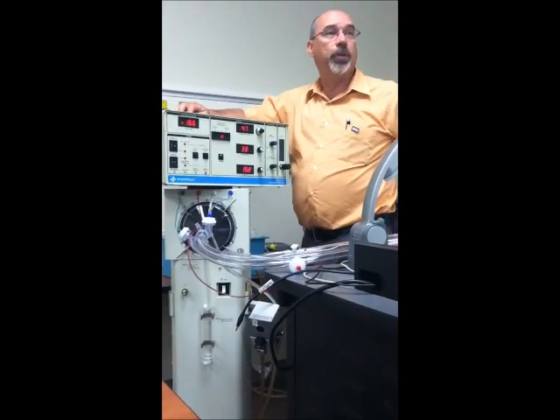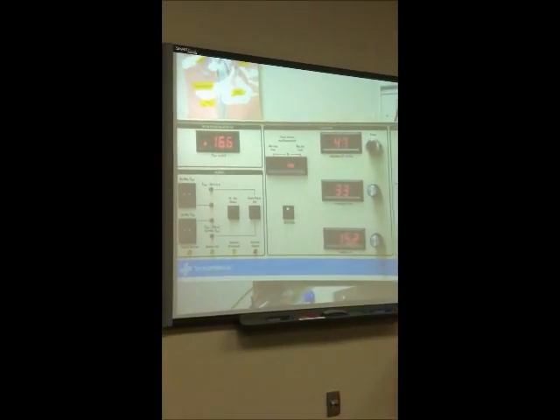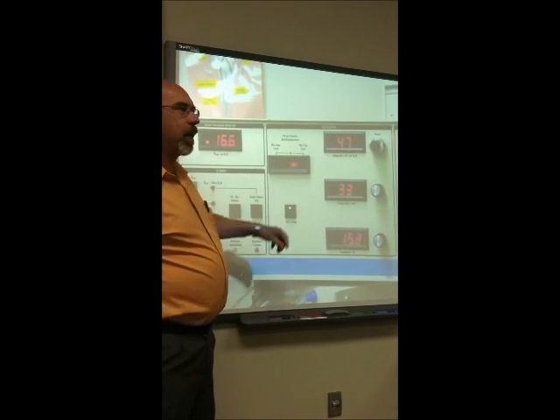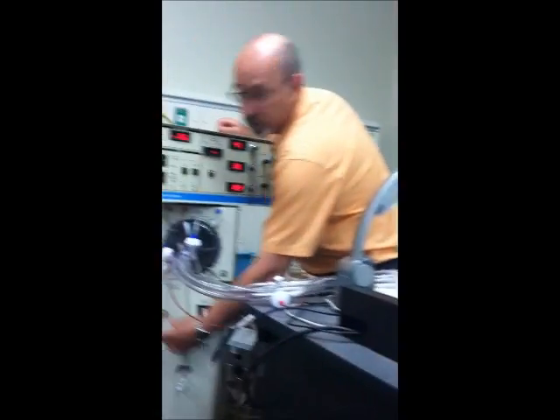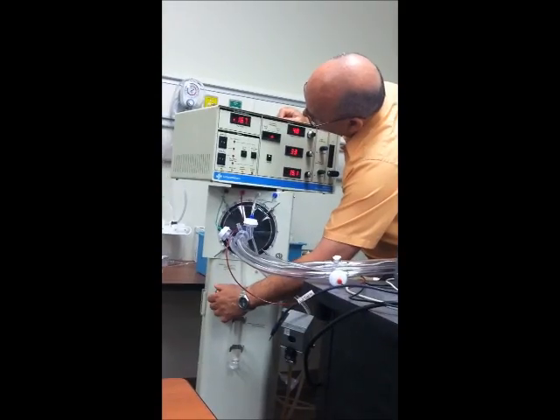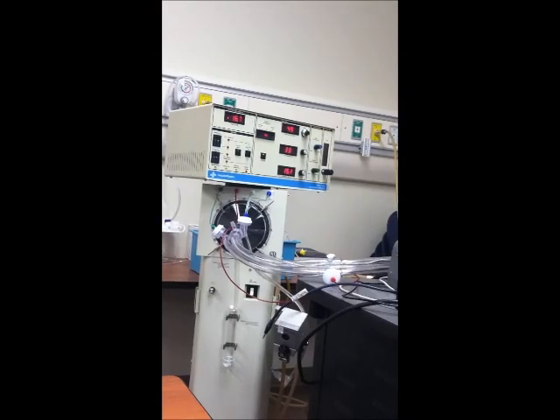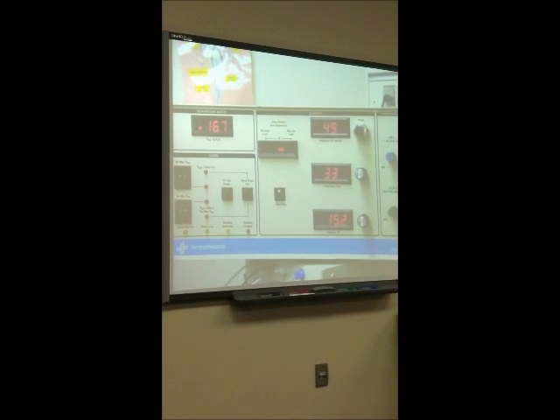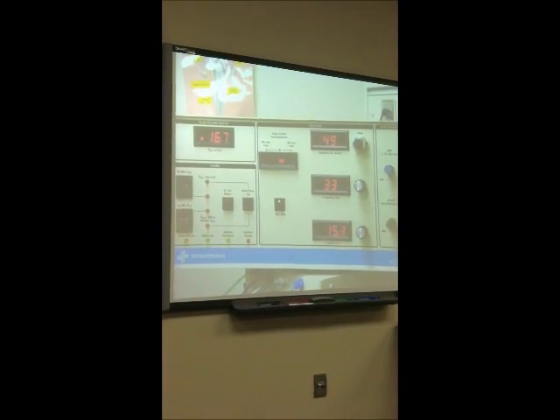How's that piston look to you? You can actually probably see it better than I can. All right, so we're too far to the right, would you say? So I need to take my piston back a little bit. What do you guys think? A little bit more? So again, this isn't something you'd have to do on the other.